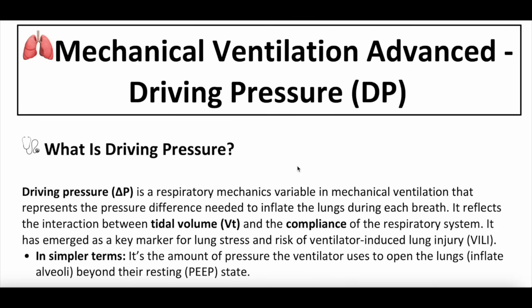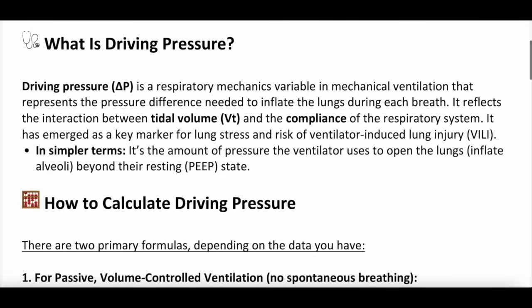Let's dive into driving pressure. What is driving pressure? Well, driving pressure is a variable that we can determine when someone's on mechanical ventilation, okay? It represents the pressure difference needed to inflate the alveoli during each breath. And we're going to come back to that as a concept, okay? So it kind of represents this interaction between tidal volume and compliance of the respiratory system. And it's really emerged as a marker for lung stress and possible risk for ventilator-induced lung injury.